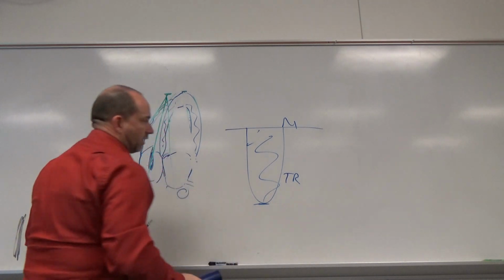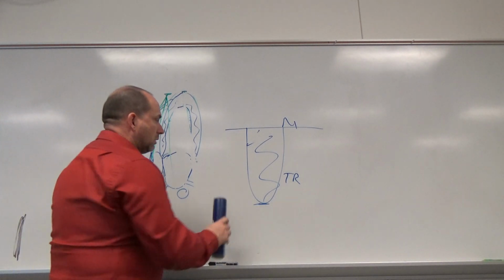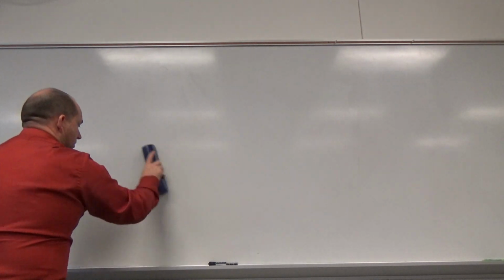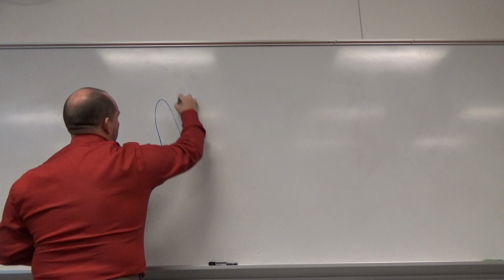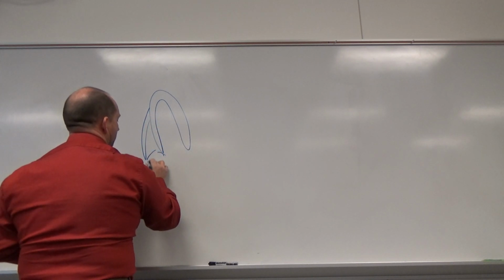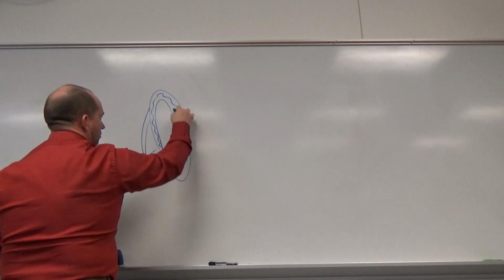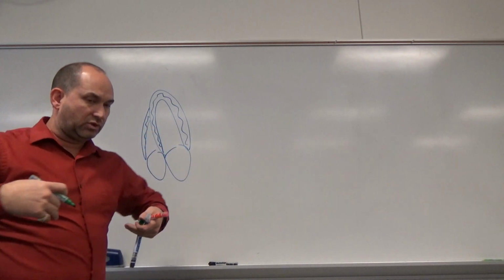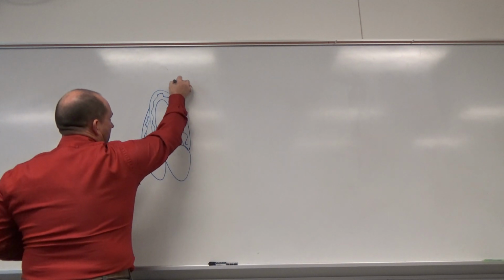Now, that is getting us a great Doppler angle, but we're going to now measure the size of the right ventricle. And this is how the ASE recommends that you do that. So I'm just going to redraw this so it's not so messy. We're going to use the left ventricle now to create a window to the right ventricle. I'm drawing it a little bit off axis here because what we're going to do is go to 4-chamber and go more lateral to it. So the transducer's coming in from this perspective.